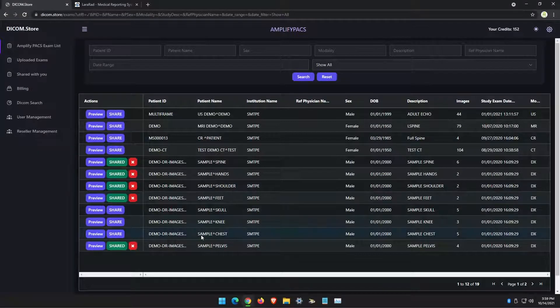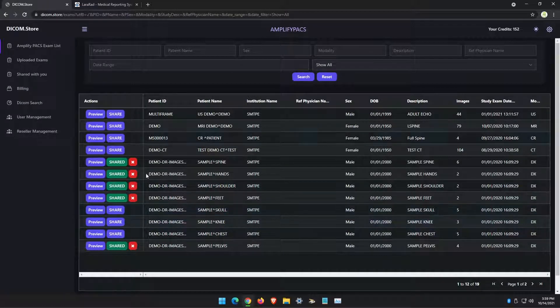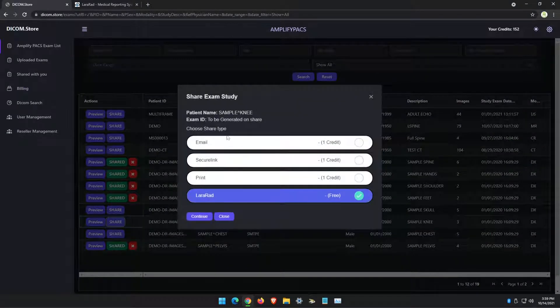In this video, I'll show you how to share images online using DICOM.store that is linked to your Amplify PACS account. To share an exam, all you need to do is click the Share button on the exam, and you'll have several options listed here.